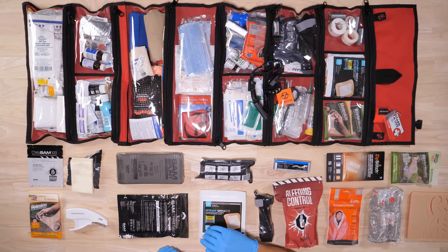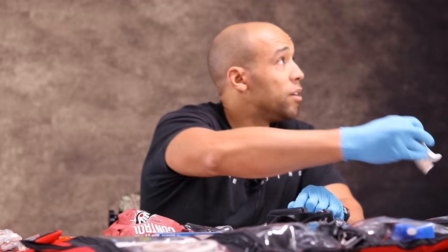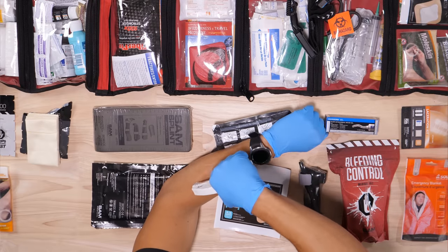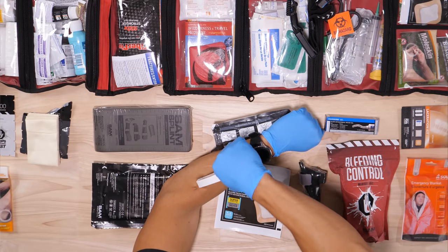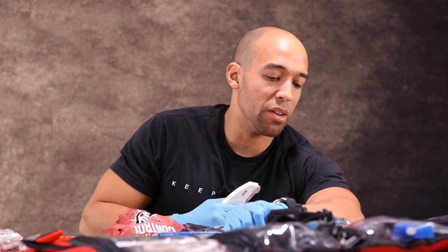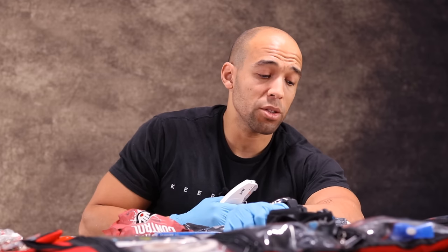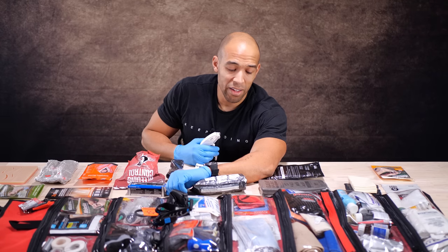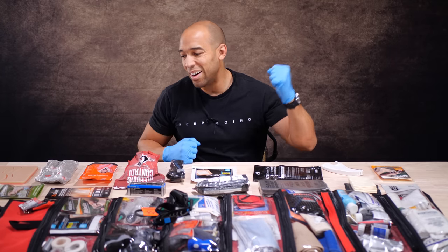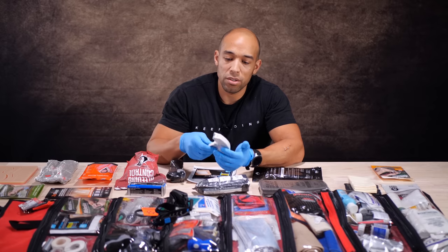The fact that it only costs probably 10 to 20 bucks is not a bad deal. Next we have the skin stapler — I've demonstrated this on the channel before, but for science I'll do it again. That hurt — the first one didn't, but the next two did. I'll be brutally honest: I made this video last night and the production was poor, so I did it again today and it looks like I put the stapler right on top of the old staple. We'll leave it in for a while.